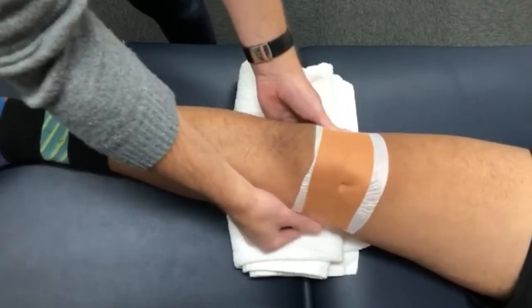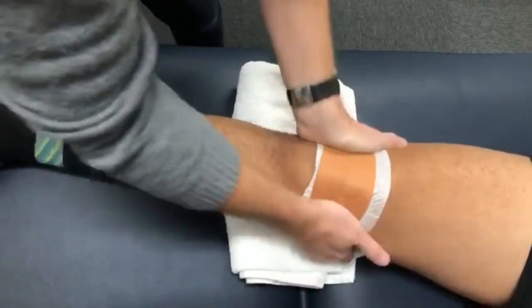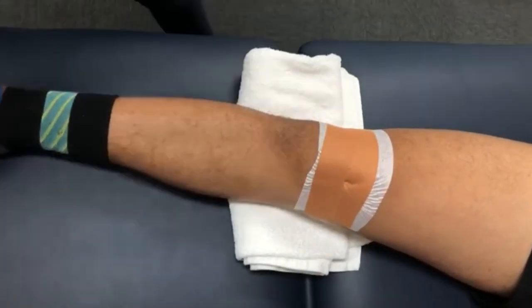Make sure to rub everything down and paste it really nicely so that it sticks and stays on for some time. It's also key to note this can be used for various knee conditions, so give it a try and see if it helps you.